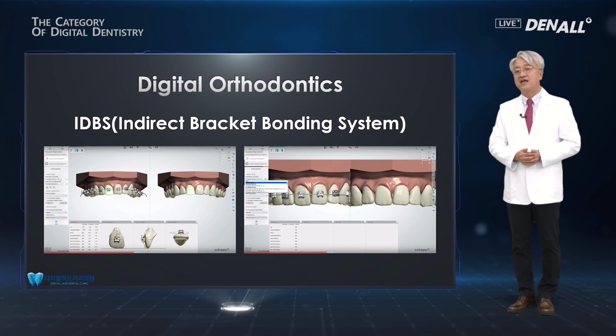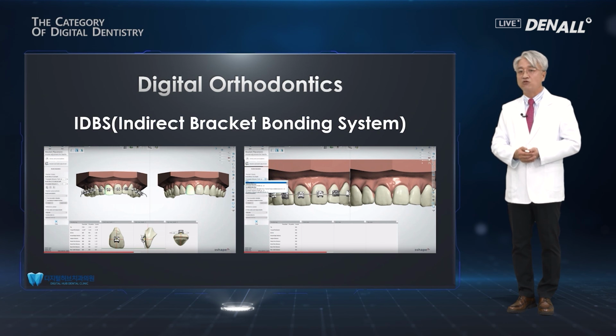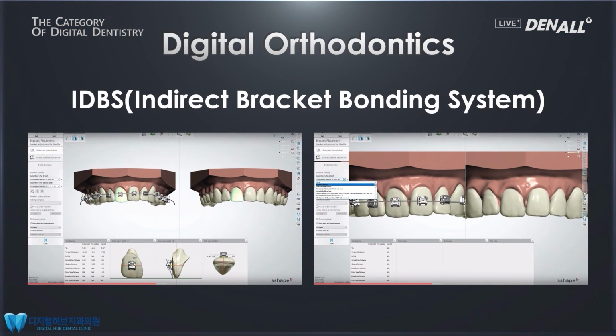So mostly, here digital orthodontics is possible mostly with the setup and teeth analysis using calipers or tape measuring. You had to use those tools, but now it can be done automatically. So you can do indirect bonding like this.